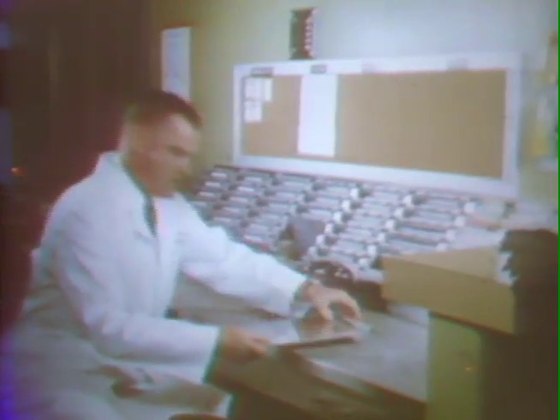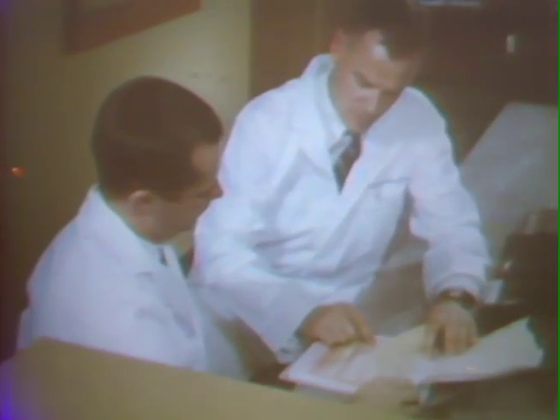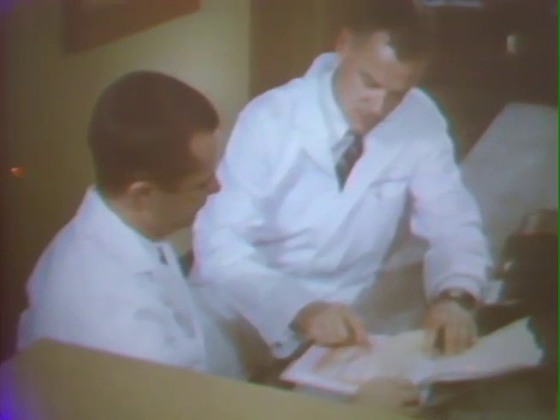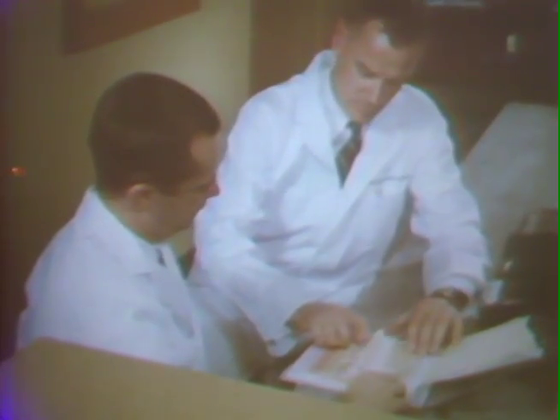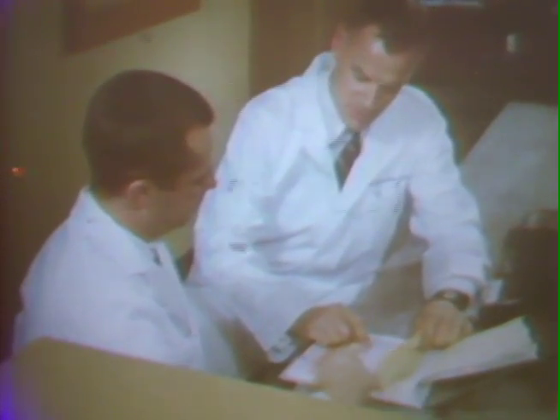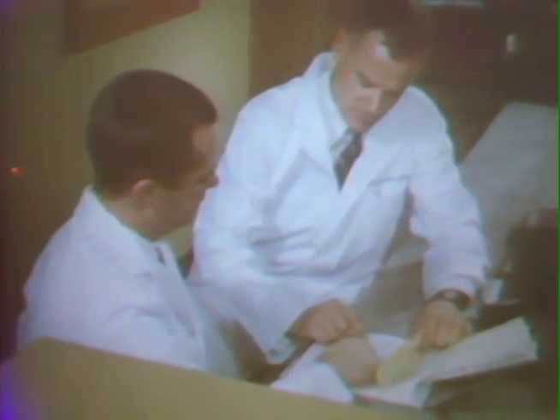The clinical management of any anesthesia begins with a preoperative consultation with the patient and, if possible, the patient's family. The resident prepares for this consultation with the assistance of the staff anesthesiologist. He studies the patient's record with special attention to the medical history, the physical examination, the laboratory and X-ray findings, and the impressions of other consultants.